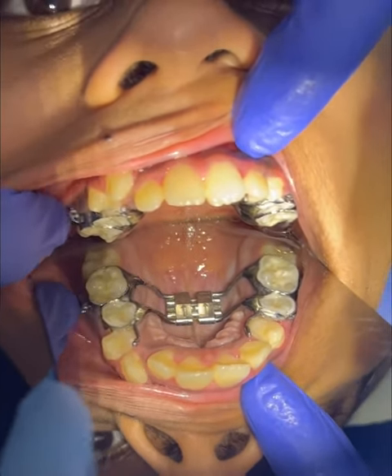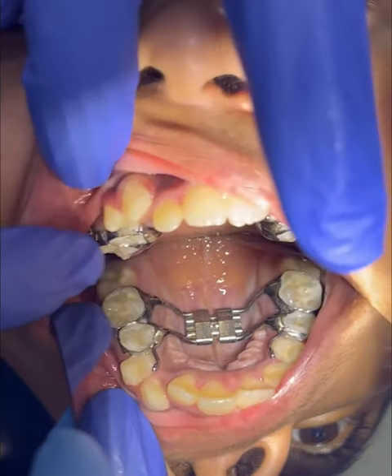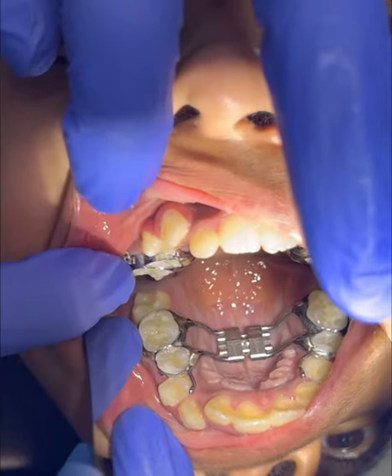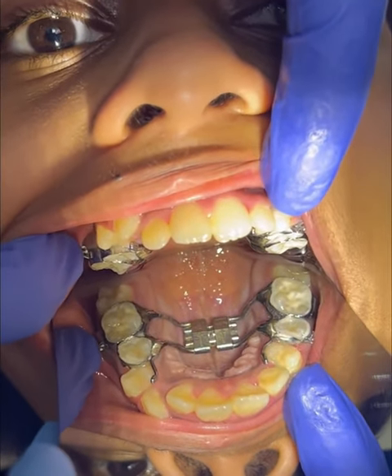This is called a Rapid Maxillary Expansion, specifically a bandaid Rapid Maxillary Expansion, where we take support of the premolar and molar to carry out expansion of the upper arch. This is called a skeletal expander.